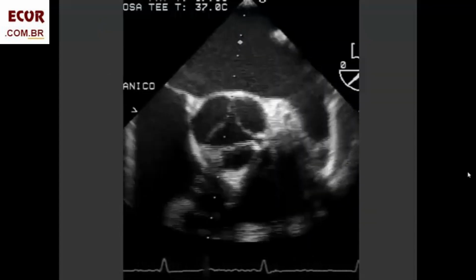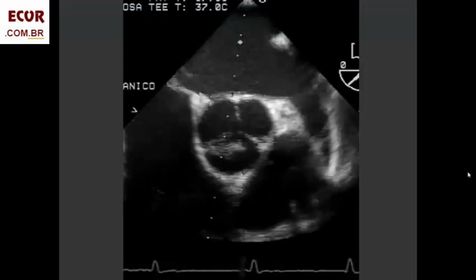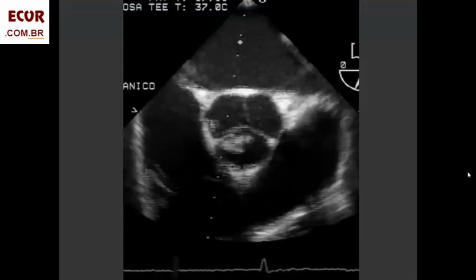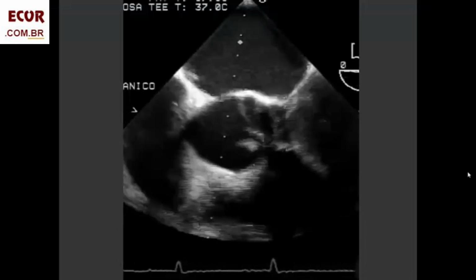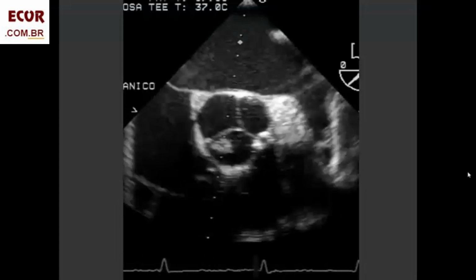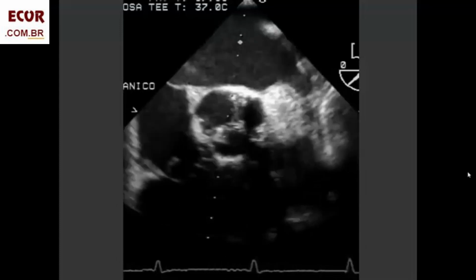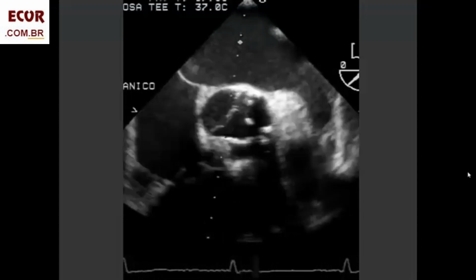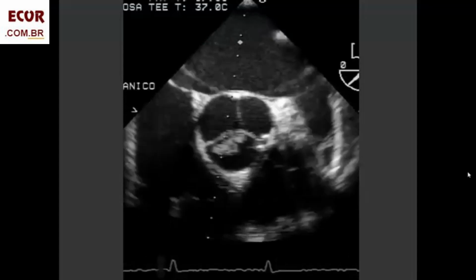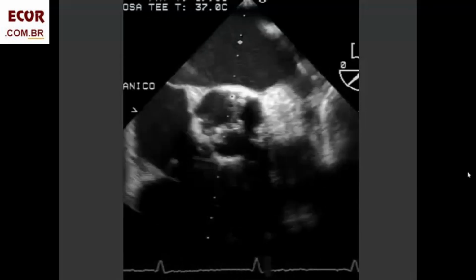Here an example. Transesophageal echo seeing the aortic valve in short axis with a small pediculate echogenic mass attached to the aortic cusp. Usually it does not impair the function of the valve unless it becomes too big. The main problem it causes is the possibility of embolism. One can suggest it being a papillary fibroelastoma if these features are found, but only surgery can diagnose it.